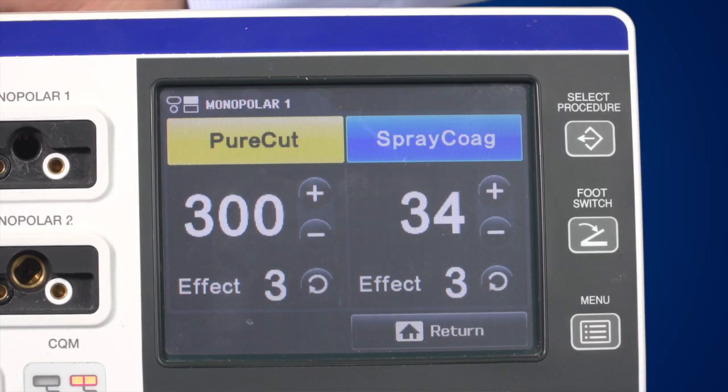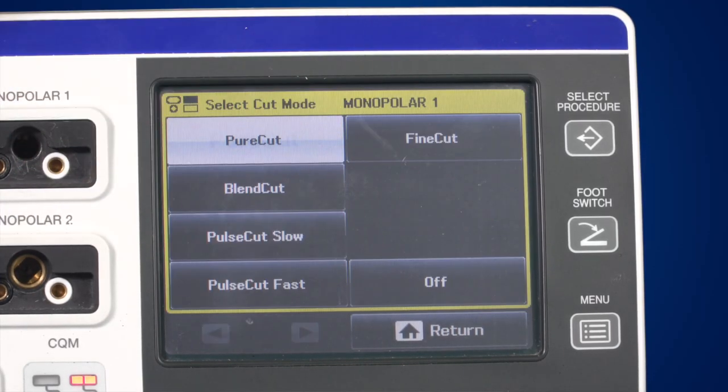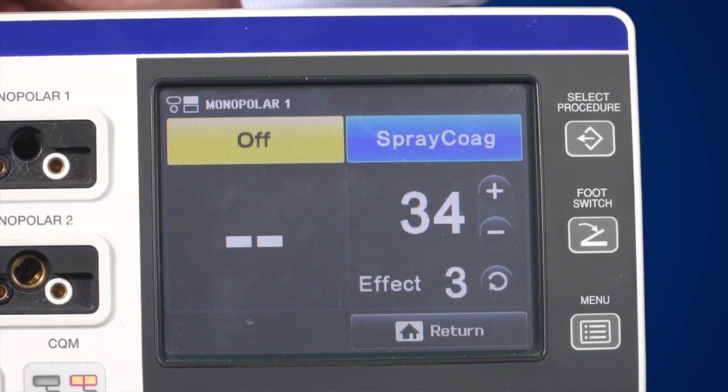The third layer on the graphical user interface is the mode layer. It allows you to change the energy waveforms or switch off the mode altogether, which can prove useful to prevent inadvertent activation.